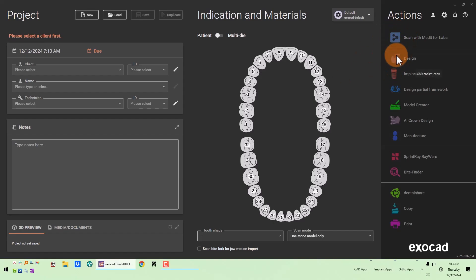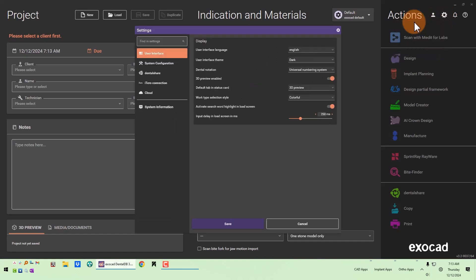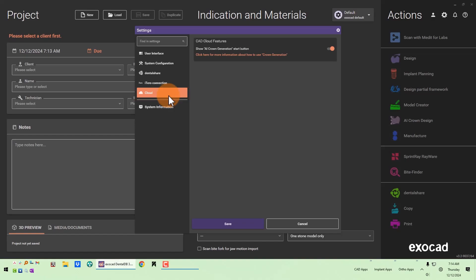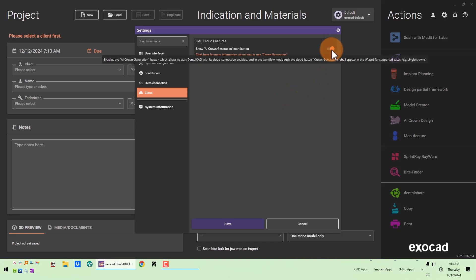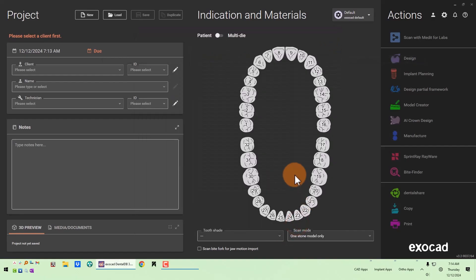The first thing you need to do is open your DentalDB. In the upper right, click the settings gear icon and go into Settings. In the main settings menu on the left-hand side you'll see the Cloud option. Click that cloud option — the CAD cloud features option is unchecked by default, so you'll have to check that to enable it, then click Save and restart your DentalDB.